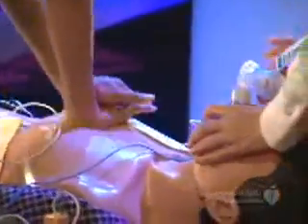Deliver shock now. The AED will then tell you when to push the shock button. I'm clear, you're clear. Clear. We're all clear. When the shock is delivered, the victim's muscles will jerk. The AED will then tell you to start CPR, beginning with chest compressions.